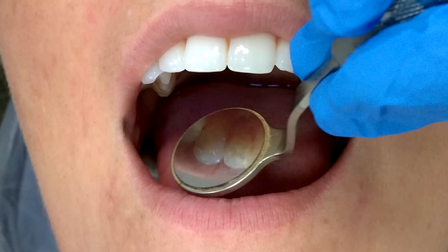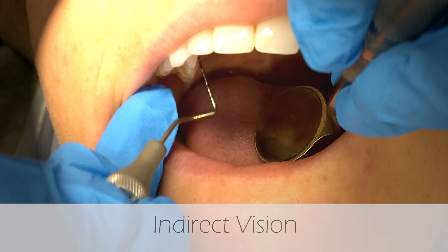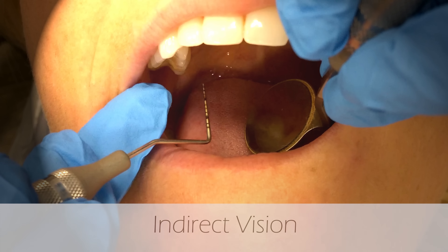There are four main uses for the mirror. One is indirect vision, and this is a difficult skill to master, but it is necessary for keeping good ergonomics.